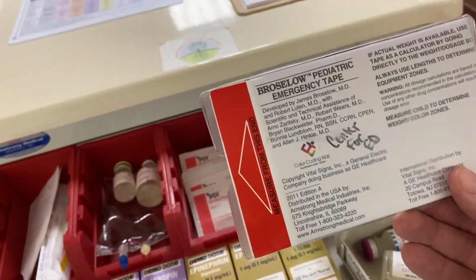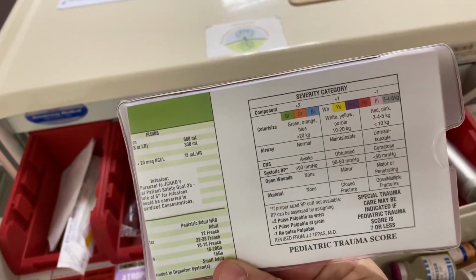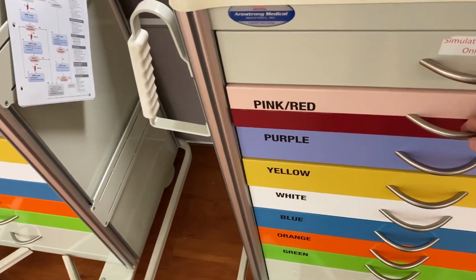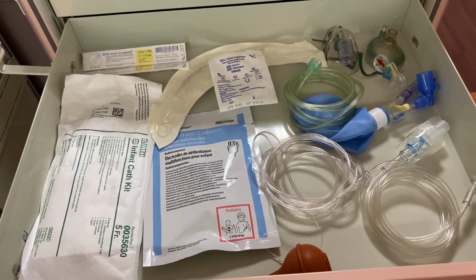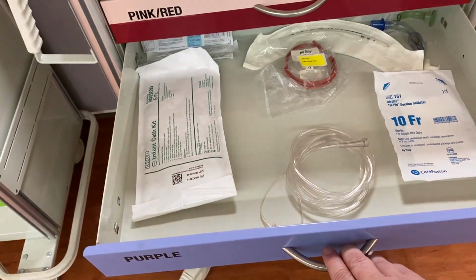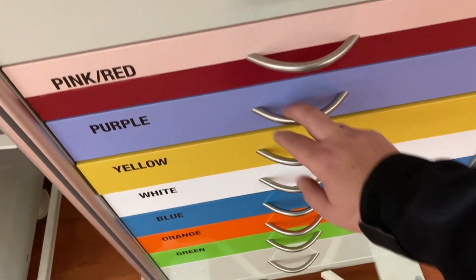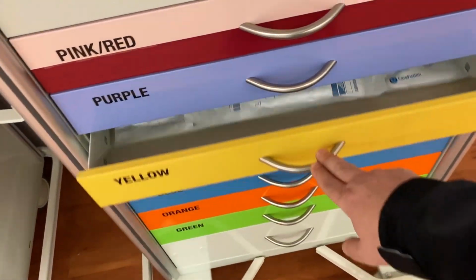Again, demo dose medications. That is the Broselow tape. When you stretch it out and you measure it with the size of the patient, it tells you which drawer to use specific to that. And each drawer has the appropriate sized equipment located in it. Again, these get used a lot. We do a lot of pediatric advanced life support classes, and so these are constantly having to be refilled and supplies changed out.